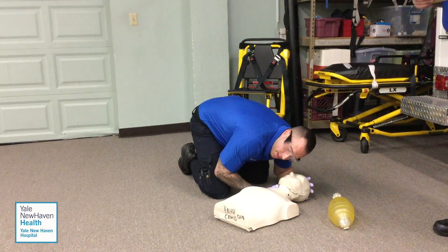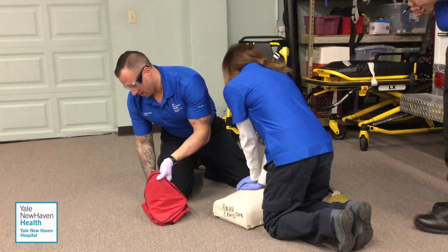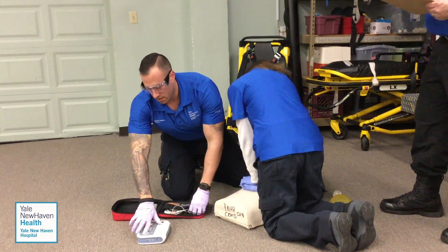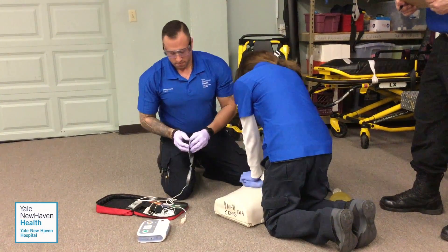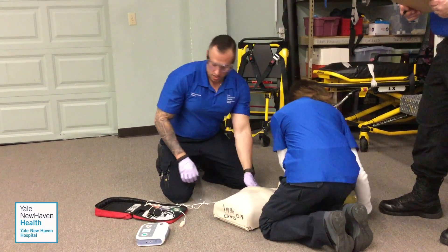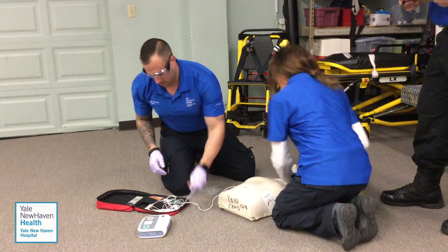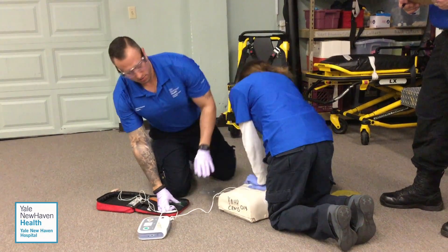Still no pulse. AED comes in — take over compressions for me. I'm going to operate the AED. I'm going to turn it on — that's the first step. I'm going to choose the adult pads, apply one to the upper right, apply one to the lower left, and plug in the connector.